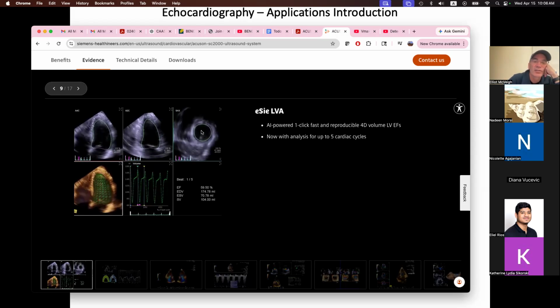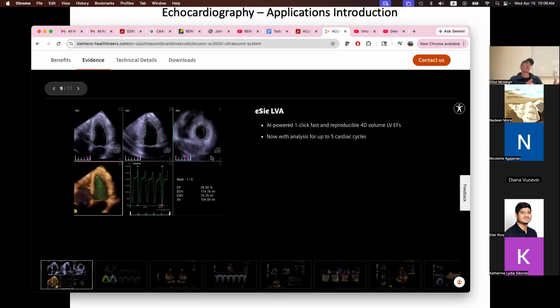And what happened was this ultrasound data is being taken in 4D. Remember we said we had about 2,000 views a second? It's dividing up all of those views to collect the entire volume at a certain temporal resolution.